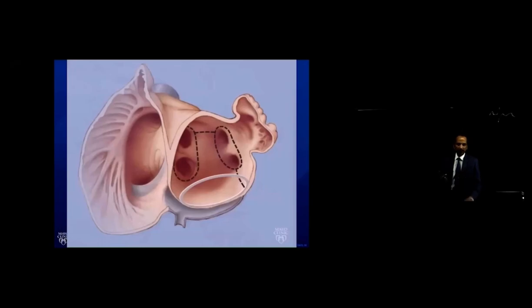For example, we entrain here, but entraining here is way off. That should suggest some posterior part of the circuit. And a simple solution could be completing an isolation of the right upper vein in some patients, depending on what the rest of the map is, what you're going to have to ablate and isolate anyway, and what the entrainment at multiple sites is.